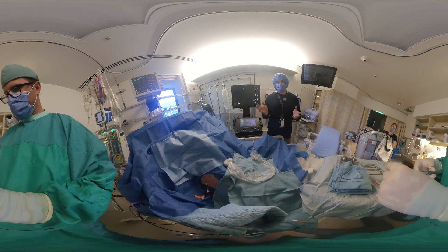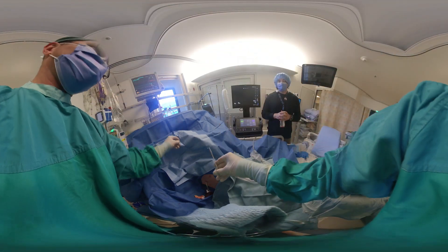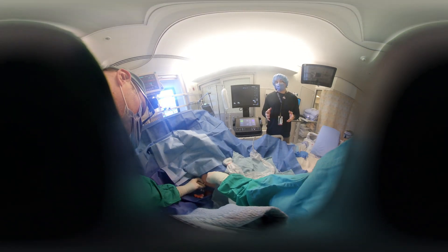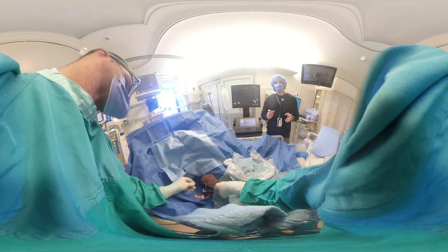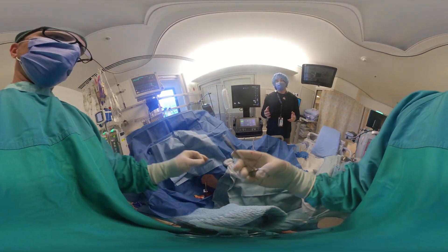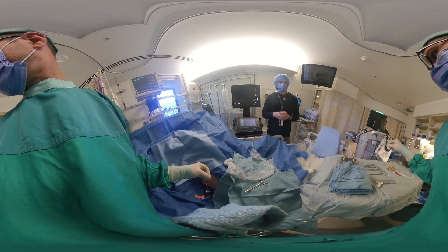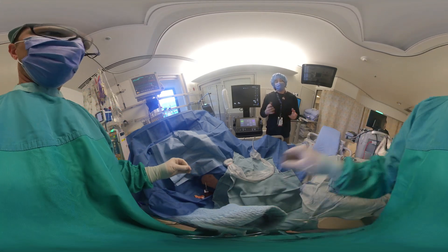Then you'll hook up the catheter to a pleuravac system. I would not encourage leaving a three-way stopcock between the catheter and the pleuravac because it shrinks the lumen size. If you want to stem the flow of pleural fluid, you can always clamp the chest tube itself. With this kit there is a luer lock to a Christmas tree adapter to connect directly to the pleuravac system.